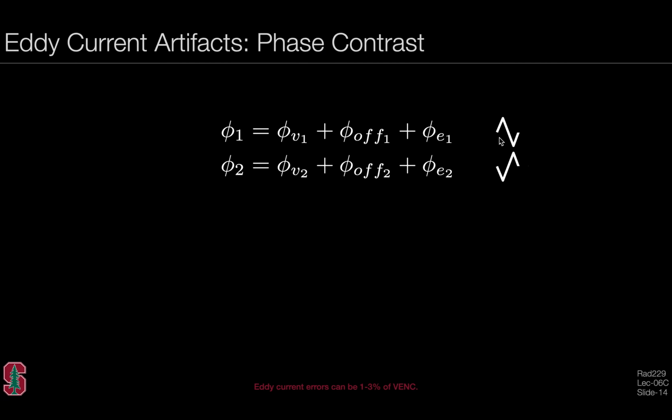So we could encode with this gradient waveform, which starts positive and goes negative, and that would have some velocity sensitivity. And then we could do a second experiment where we use this bipolar gradient, and it has an equal and opposite velocity sensitivity. And the delta M1 of these two gradients would give us the M1 that we wanted for a specific VENC, for example.